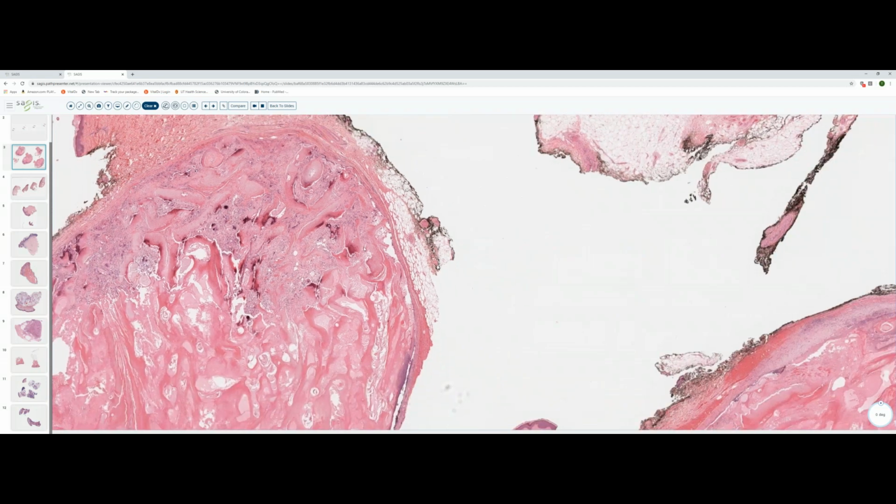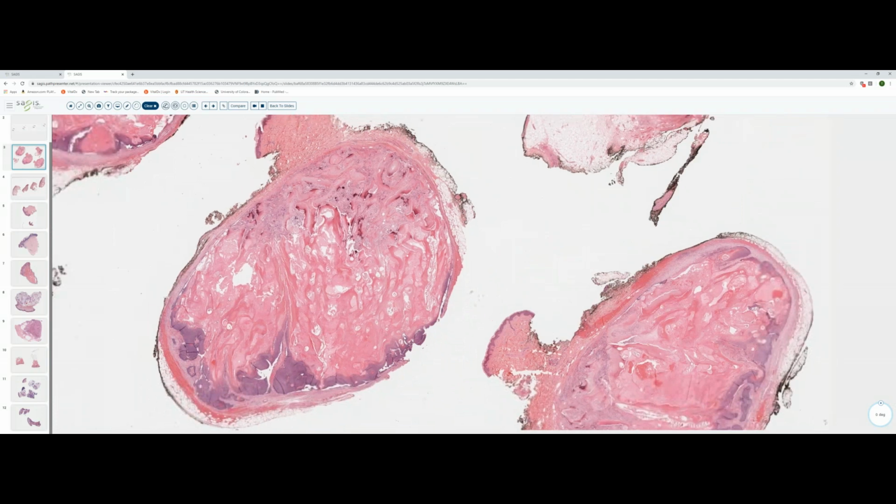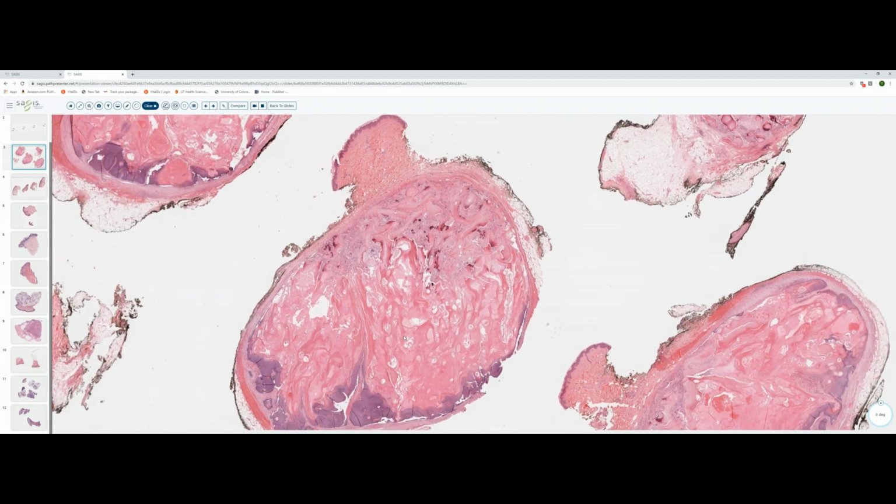The other point that I'd like to make is, rather than thinking of pilomatricomas as follicular tumors, really you should think of them as a matrical cyst. If you think about the two other types of follicular cysts that we see, an infundibular cyst or EIC shows differentiation towards the infundibular portion of the hair follicle. So we get a cystic structure that's lined by stratified squamous epithelium that keratinizes with interposition of a granular layer and that contains keratin that has that shredded wheat appearance.